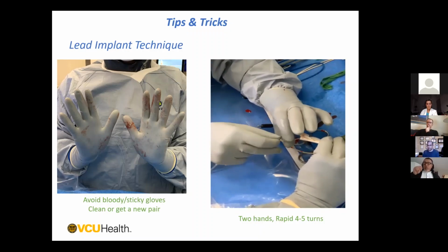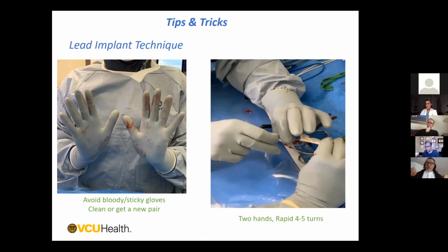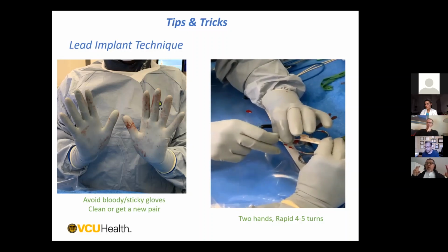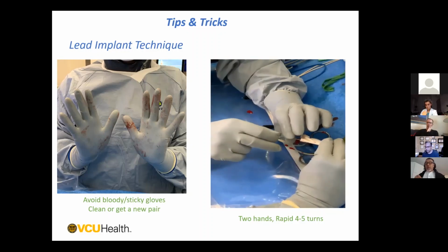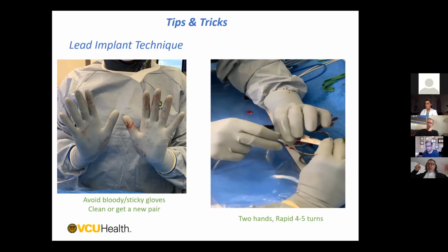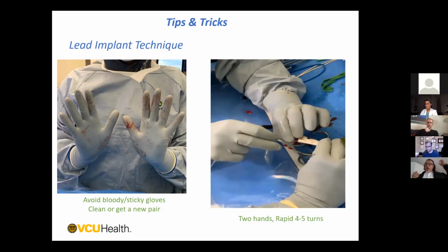So now I usually pre-charge the lead in the introducer, and before putting the lead and the introducer inside the body, I make all the turns. I want to be sure that when I'm turning inside, it's already transmitting the torque through the muscle. It takes like 4 or 5 turns before you are transmitting your outside movement to the tip of the lead. So I do it with everything out. Once I see that my lead is turning already, I put everything in.